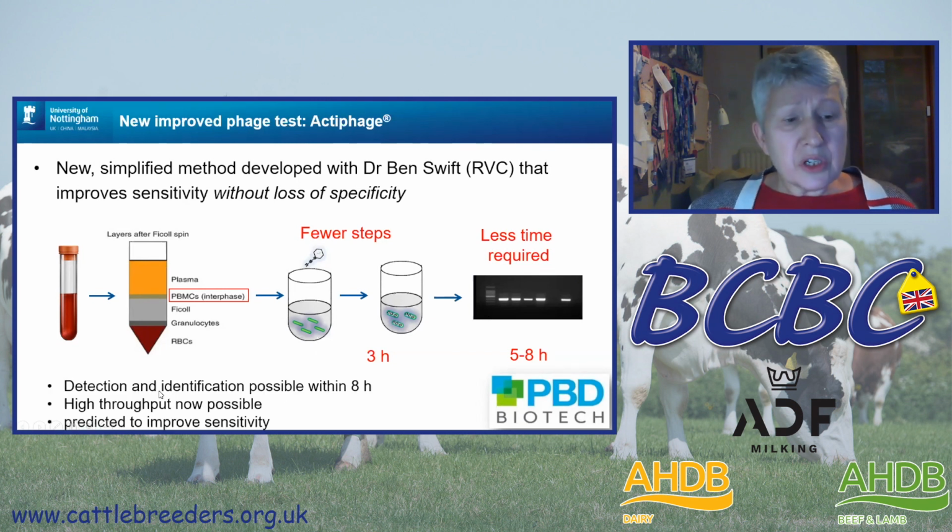So this allowed us to do detection and identification within 8 hours. This new format made it more possible to do high throughput, to do lots of samples. And because everything stays in one tube, it's much simpler. We would predict that it improved sensitivity.